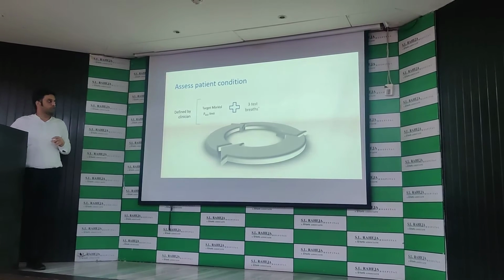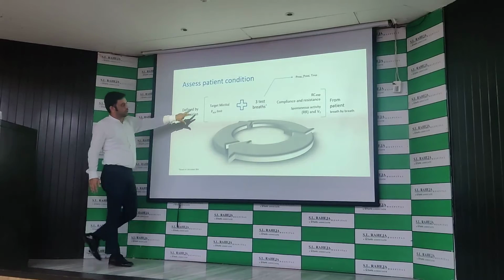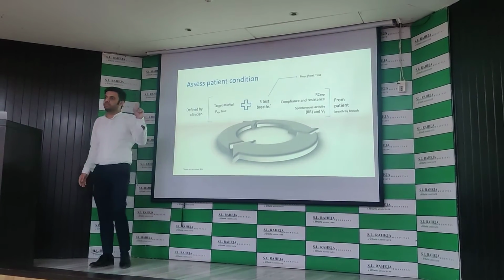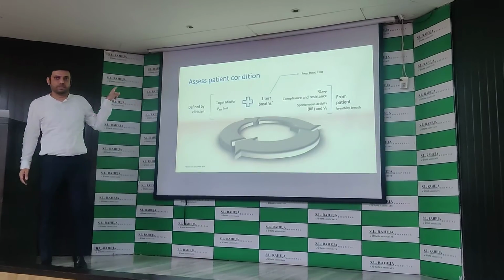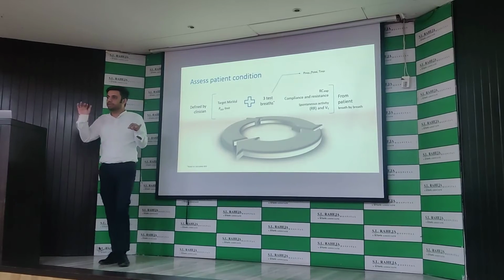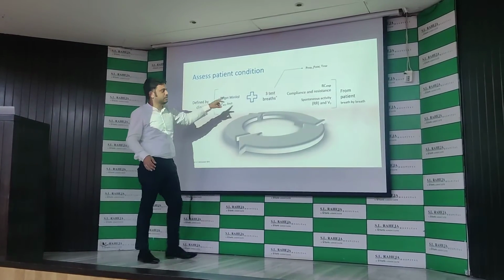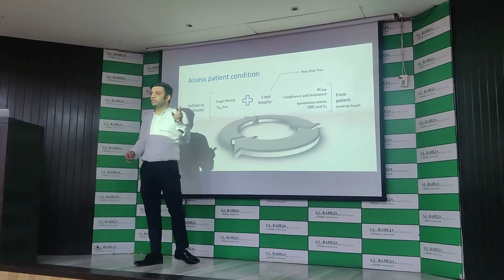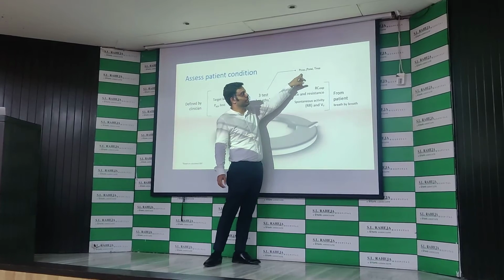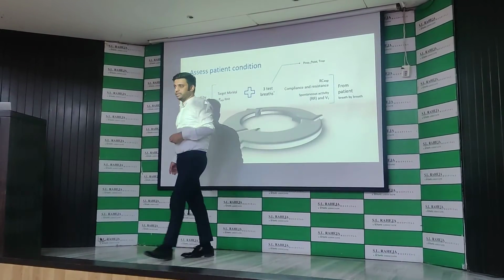So when we talk about closed loop, how exactly is it working? These two are defined by the clinician. We set the target minute volume in percentage, and we also set the PASV limit. This PASV limit is 10 centimeters of water lesser than the peak pressure that we achieve. Now, when we attach to the patient, it first gives 3 test breaths, and with those 3 test breaths, it achieves the best inspiratory pressure, the RR and the TI, inspiratory time.